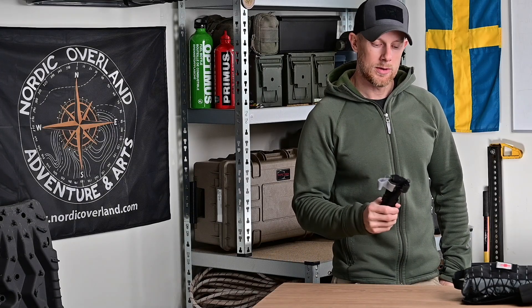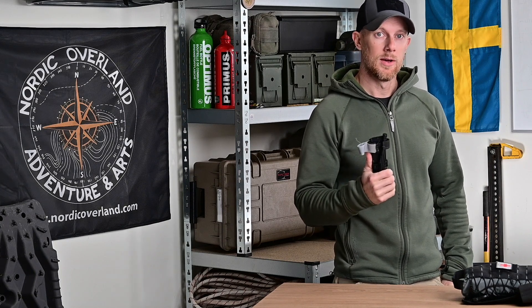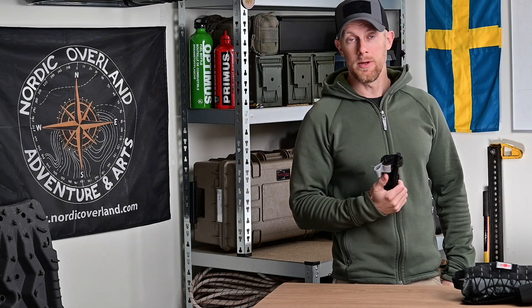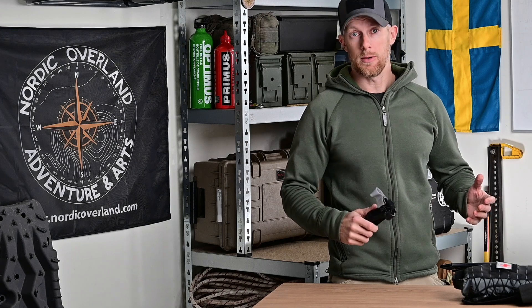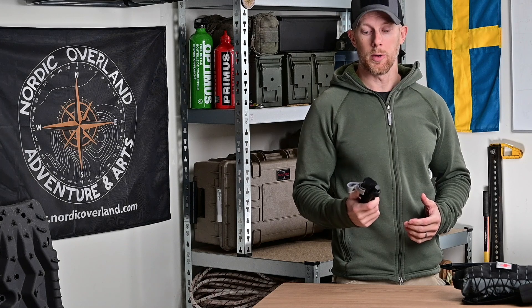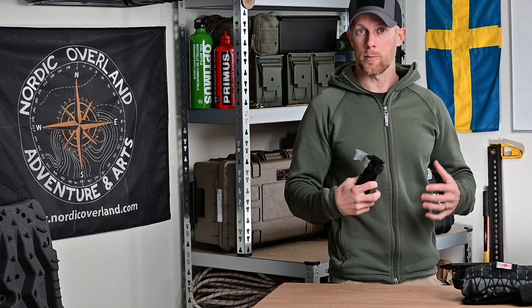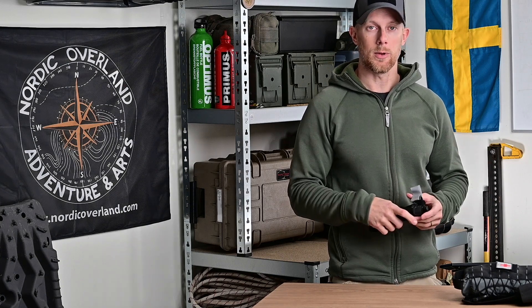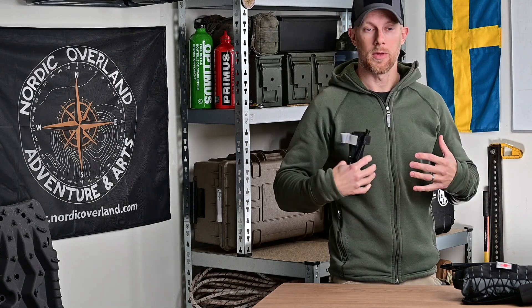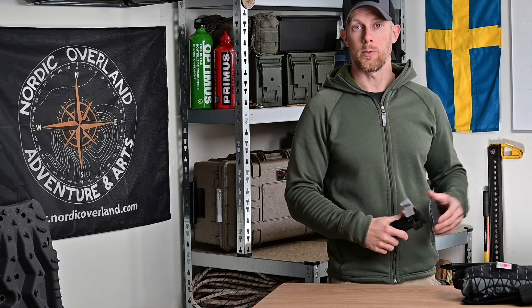I den här videon ska vi återkomma till tonikén och framförallt hur man applicerar den i ett snabbt och akut läge. Som jag har nämnt tidigare tar det ungefär tre minuter för en skadad person att blöda ut om man inte kan stoppa en katastrofblödning eller en artärblödning. Tonikén används ju endast på armar eller ben – den fungerar inte för artärblödningar i och kring hals, nyckelben, armhålor, bäcken och ljumskar. Där får man använda metoden tamponering.